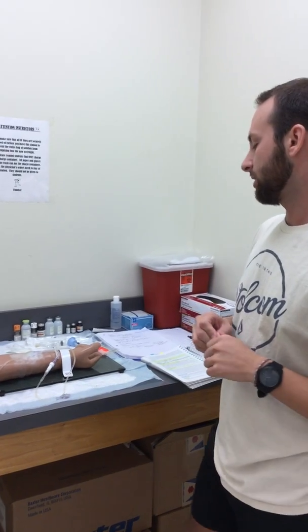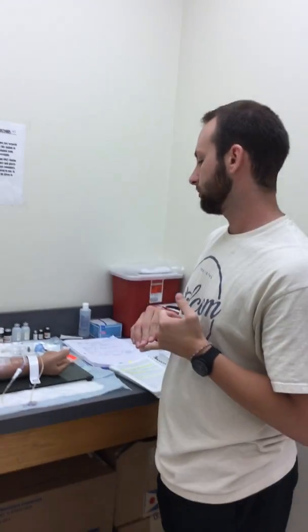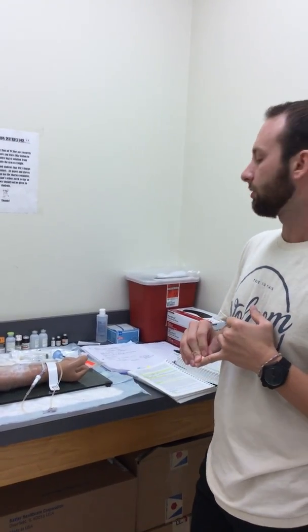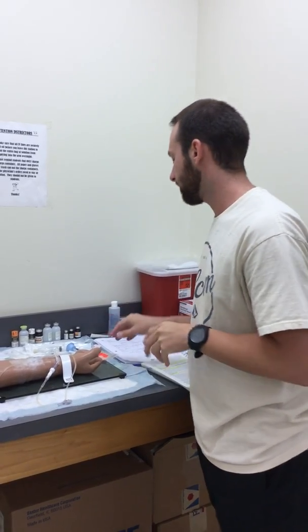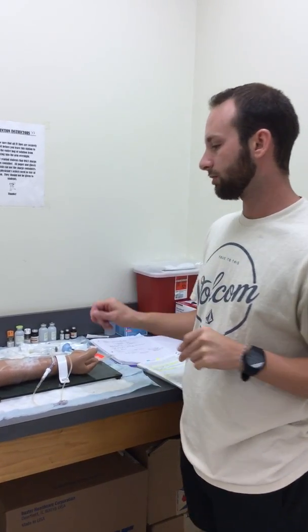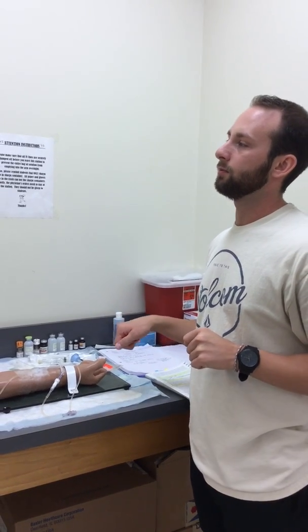Now that we have our medication confirmed and it's right, we're going to go on to our patient's room and make sure that we have all our correct stuff. So we're going to want to make sure we have alcohol swabs to clean the ports before we give the meds, and we always want to check allergies again when we get in the patient's room and make sure that nothing is interfering with the meds.